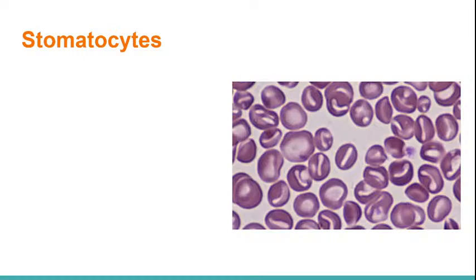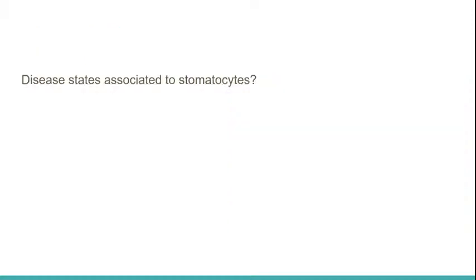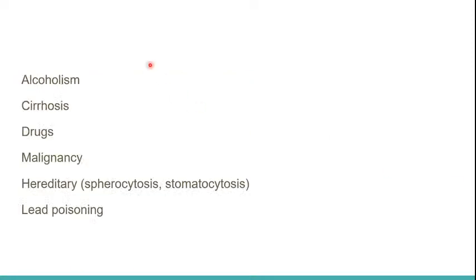All right. Now, the disease state associated with stomatocytes is, of course, hereditary stomatocytosis, but there are several other causes as well: alcoholism, cirrhosis, drugs, malignancy, and lead poisoning.